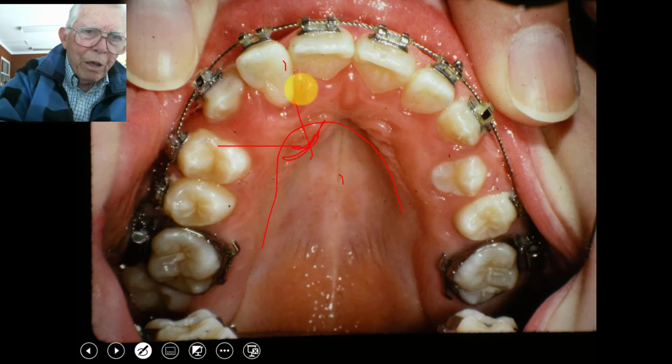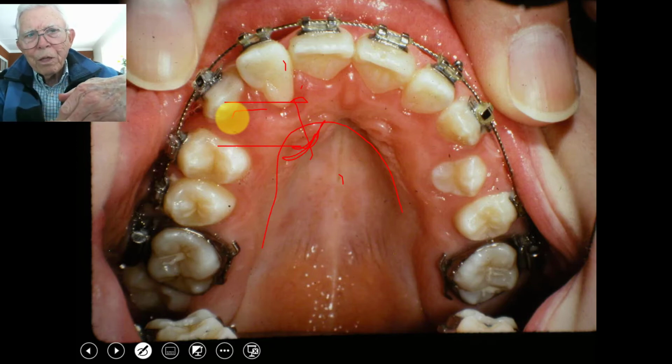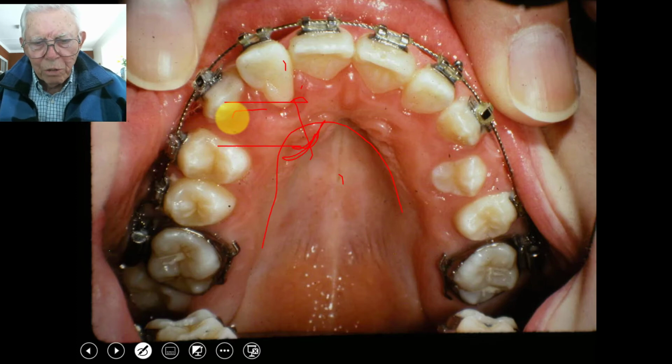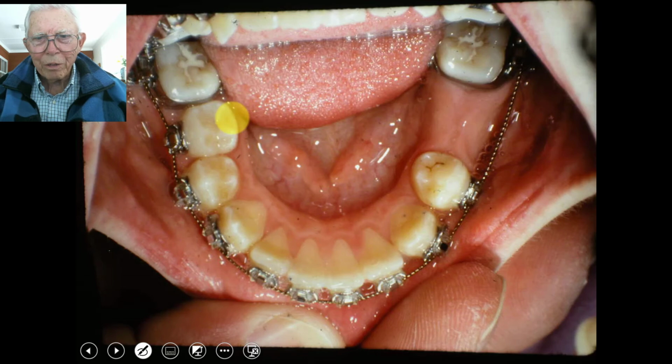As you're dragging the cuspid across the lateral, let the lateral just float in, and you drag the cuspid over it, and then you drag the root of the lateral back. And you'll watch this lateral change. I love to get these cases and just figure out ways to correct these problems, and this is a good one to learn on.